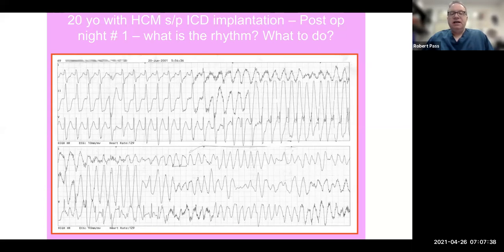And the reason that it's not asking for 100 out of 100 or 12 out of 12 is because, as you see in ventricular fibrillation, the QRS complex and the ventricular electrogram are changing from beat to beat. And so in recognition of the fact that the electrogram may change in size, the defibrillator is programmed to essentially look at an average over a period of time.